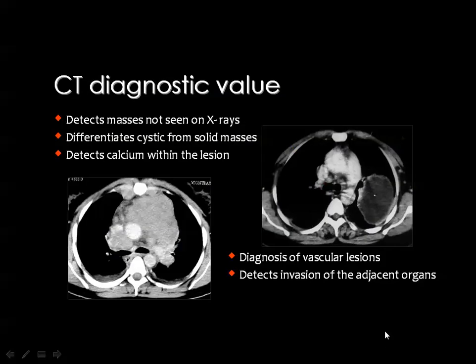Then, what is the role of the plain film? What is the role of CT? And what is the role of MRI? And also, there is a good role for diagnostic ultrasound in evaluation of mediastinal lesions.